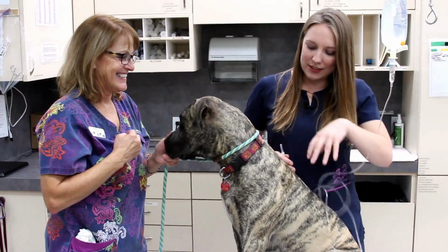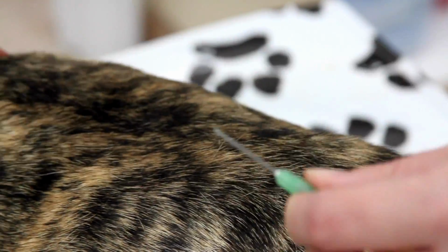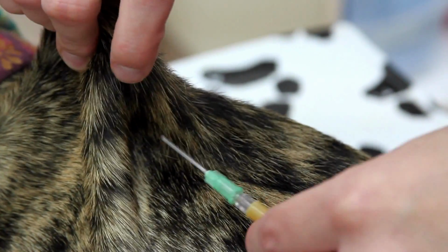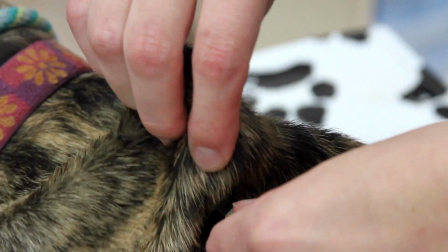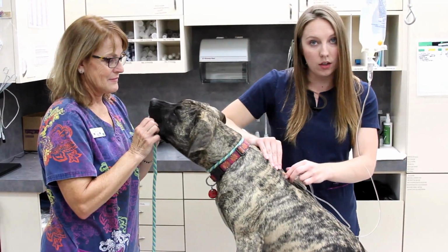We're going to grab her skin here, kind of in the shoulder blade area where there's more extra skin, and we're going to take the cap off of your needle and we're going to insert it in this little tent area right here. So you're going to insert the needle. You can then release the skin that you were holding, but just keep hanging on to the needle.